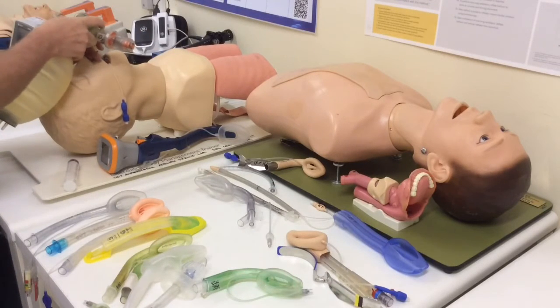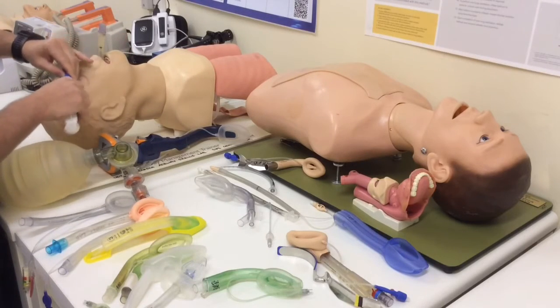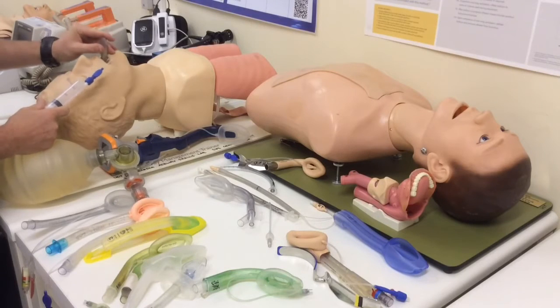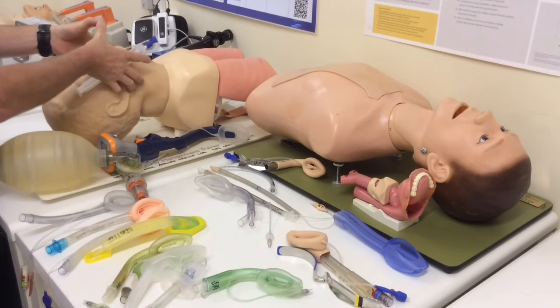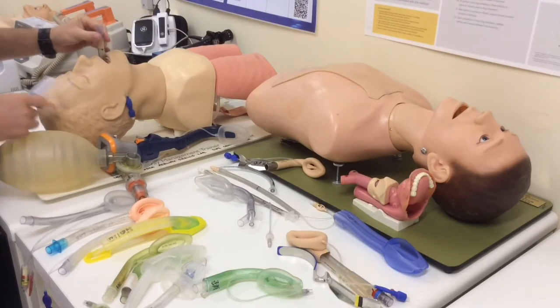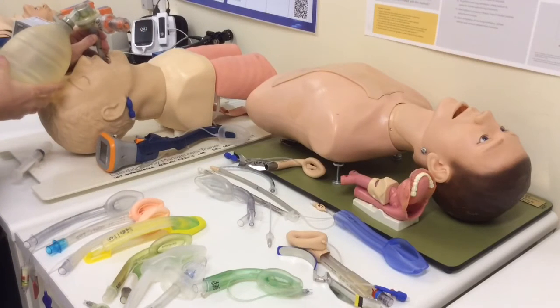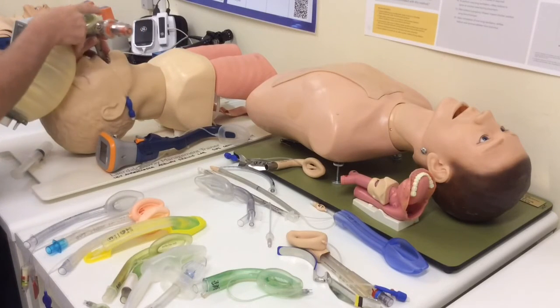If you don't get good ventilation or good sealing, what you can do is deflate your cuff a bit and advance the device a bit further. Sometimes doing a jaw thrust and advancing the device will help, or you do a jaw thrust and let someone else move it, and then inflate the cuff, drawing it back slightly until it seats well while providing ventilation, to find that optimal spot where it ventilates best, and then secure the device.